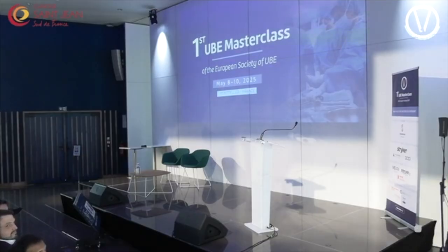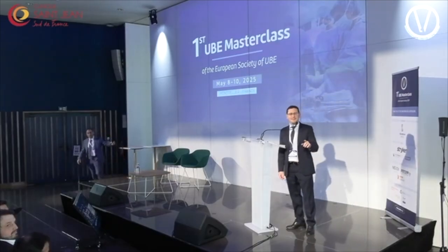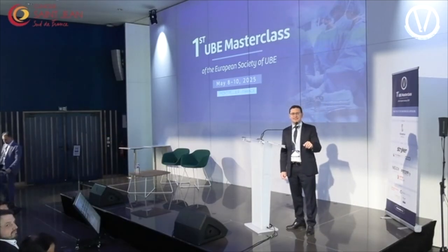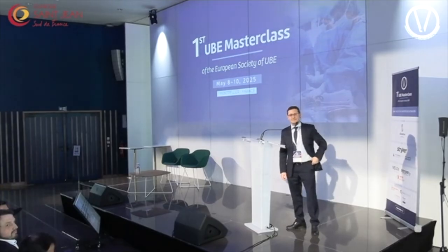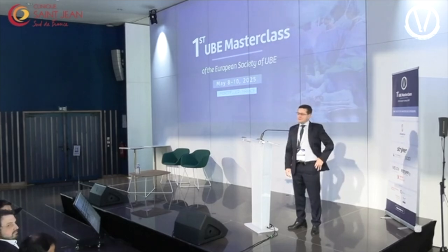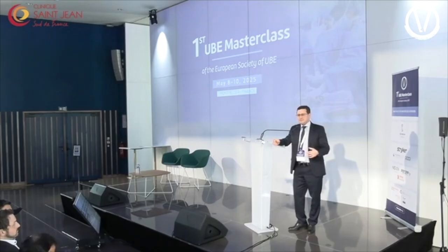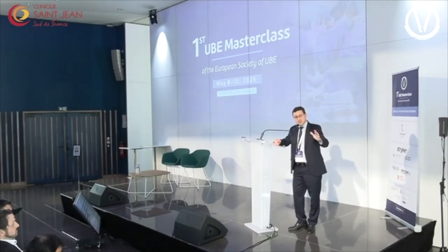Ariel, you use a lot of translaminar, contralateral. It's very specific, and I think these three differentiations are very useful. Because we say everything is sublaminar, but not everything is sublaminar. The technique of the contralateral approach is different. We're looking at this classification, and all the people say sublaminar or interlaminar, but translaminar ipsilateral is not the same as translaminar contralateral. We talk in Portugal about ipsilateral translaminar.